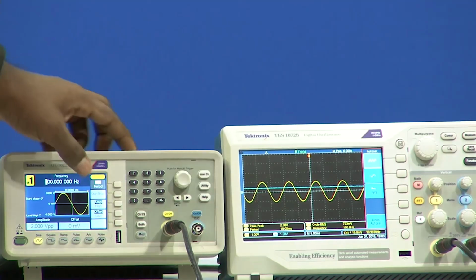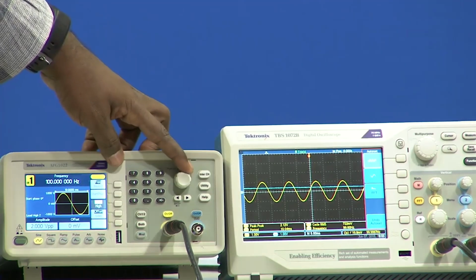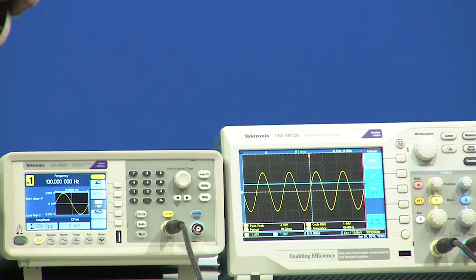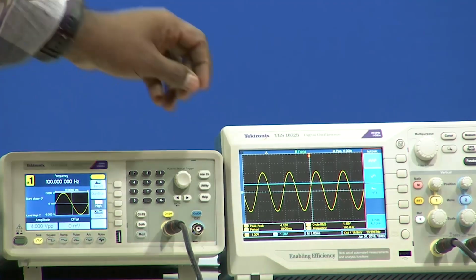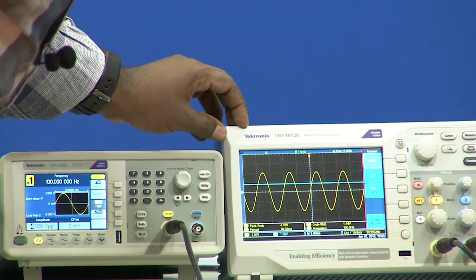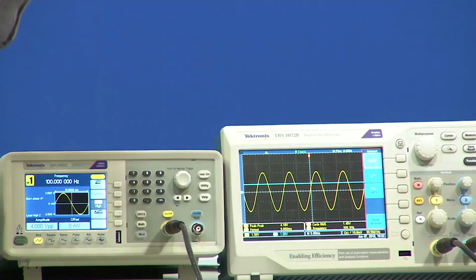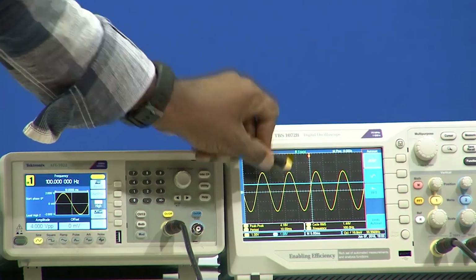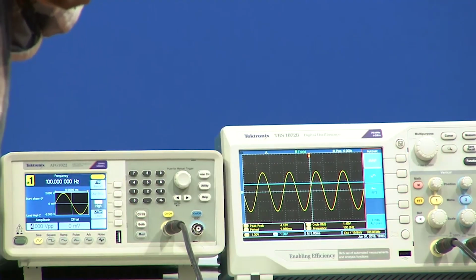Now what I will do is change the amplitude to somewhere around 4 volts. If it is 4 volts, previously it was 400, now it should be 800, right. Now if I see, previously it was at 2 levels, now it has moved to 4 levels, closely towards 1 volt, so somewhere around 800 millivolts. So that means when the input keeps on increasing, the threshold value is also increasing.